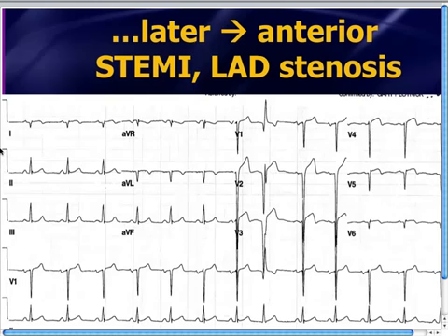So, once again, key point: you're going to hear more and more about these DeWinter T waves. Why this is important is because these patients present with ST segment depression instead of elevation. Normally, what we do with ST segment depression is treat them with the anti-anginal therapies, heparin, and admit them to the unit. But if it turns out that more literature supports that this truly is a STEMI equivalent, as it appears to be thus far, then perhaps this is one of those examples of a patient with ST depression who probably needs to go to the cath lab right now instead of waiting.